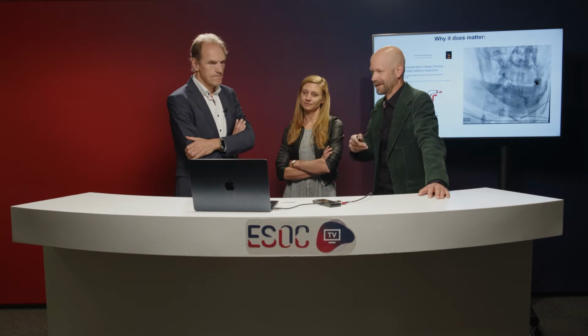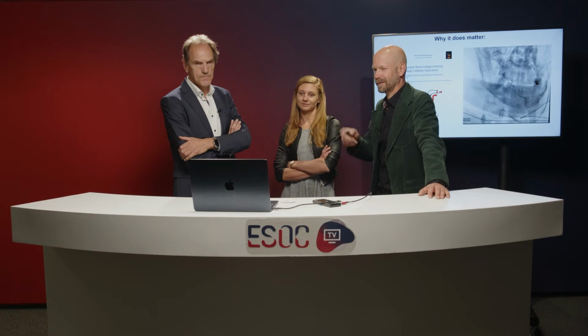So we have a good explanation. We have evidence now from your STRAIT registry that placing it more distally leads to better outcomes. So I think that's a very important message. If you use a balloon guide, place it distally, and that's possible now with the newer generation. Yeah, I think so. So then I think this is enough evidence, and I don't think we have to talk about that.